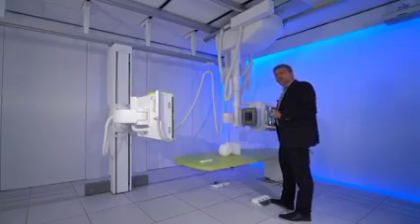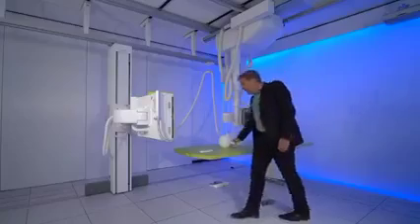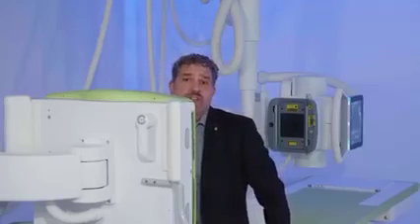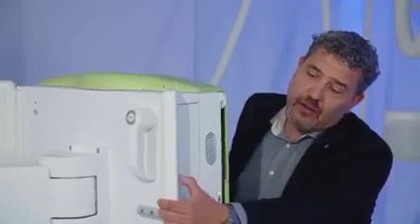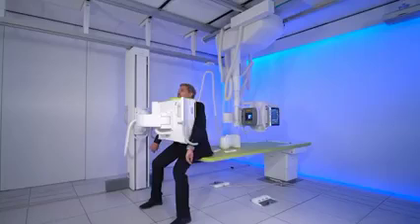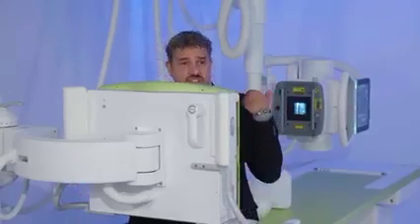You, as a user, will raise this table to a comfortable working height. And what you will get is a system where a patient could sit here on this wide tabletop. They can hold on to this tabletop in a very comfortable way while you position. And then what you will do is you will bring the wall stand towards the patient rather than bringing the patient towards the wall stand. So now I can make my chest exposure.